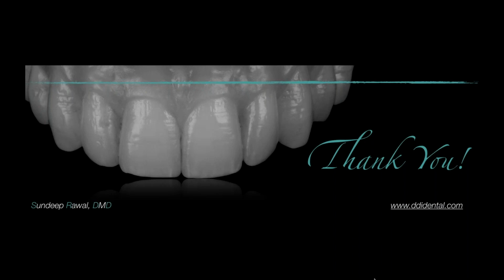It's like playing a video game, and you want to make sure you get a laptop that has the appropriate graphics card. Just make sure that you do that, make sure it's the appropriate one, set up at the right specs, and you'll never have a problem. So if you're in a totally open architecture situation, just make sure that your settings are appropriate and you'll have no issues. If you are dealing with a closed architecture system, you want to kind of stay within the confines between CBCT and intraoral scanner.